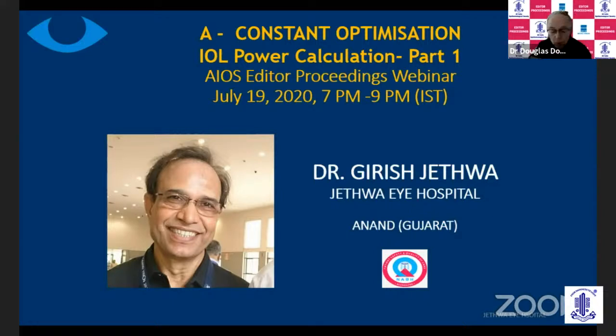That's a great point, because there was a paper by Oliver Findel's group that looked at C-loop one-piece lenses and measured effective lens position. In 20% of the eyes, the IOL shifted in position by 1 millimeter or more between 1 hour and 3 months. So we don't know which of our patients, we all have our patients who are 20/20 on day one, they come back at 3 weeks and they're -1 and unhappy. So something like you've proposed, Sri, I think is going to be critical.